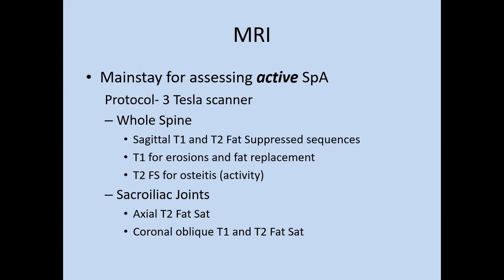So MRI here is the major test for detecting disease activity, and this is the most important part of our job as radiologists in terms of informing the rheumatologist about the situation on the MRI and whether these patients need active aggressive treatment or not.